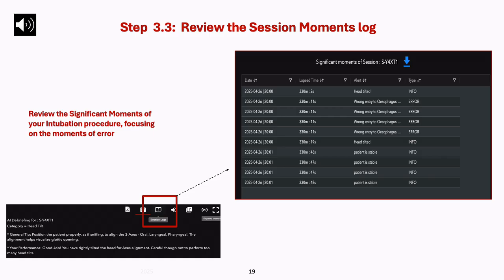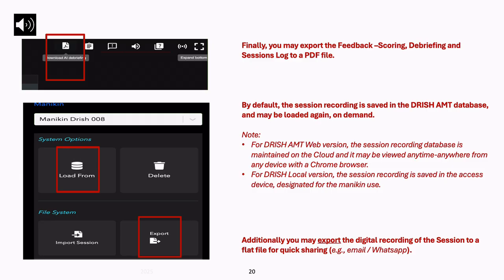Step 3.3. Here we review the session moments log. Now, there are significant moments of this intubation procedure which we may like to look back, focusing on the moments of error. We are done with our analysis now.